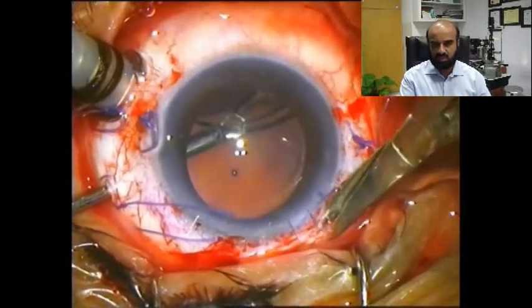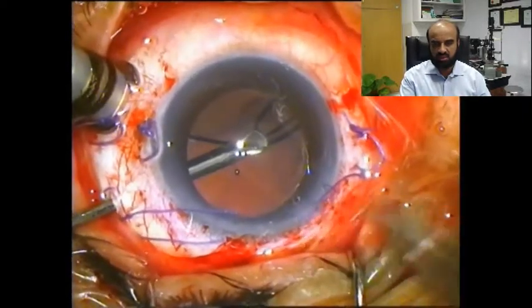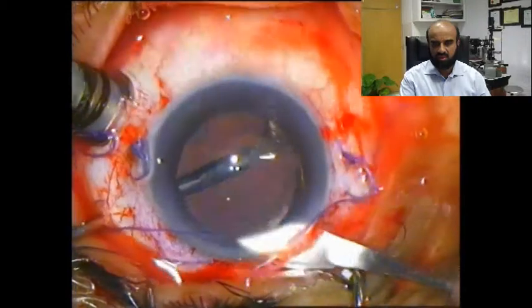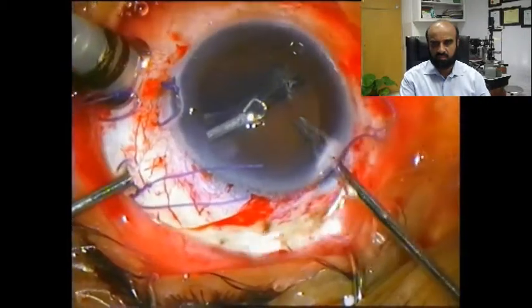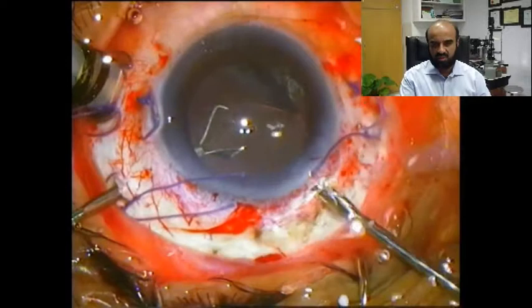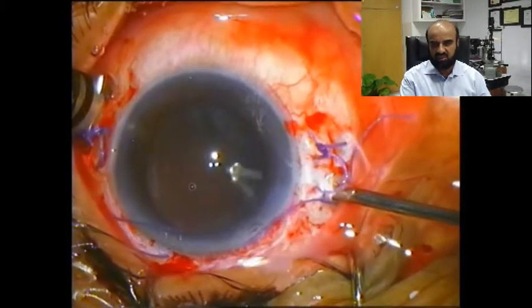A bimanual technique is going to be used to grab and retrieve the IOL. Once the intravitreal forceps got hold of the haptic-optic junction, the pre-placed sutures were cut and removed, and the wound was enlarged for easy and safe delivery of the optic of the IOL. With the handshake technique, the pseudophakos is removed once it goes out.